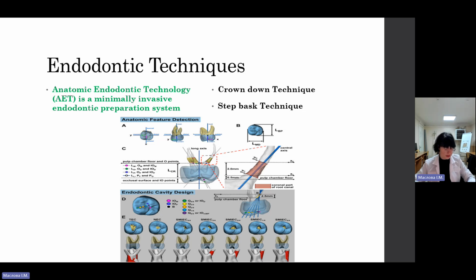so that little natural resistance is offered, a more definite shape might have to be prepared in the canal wall to help prevent overfilling during the obturation phase. When the step back technique is used, it must be remembered that the root canal in many teeth is considerably wider in a buccolingual than in a mesiodistal direction.